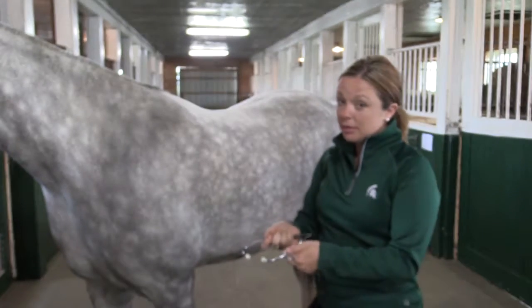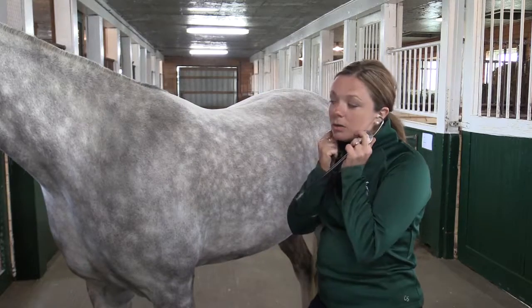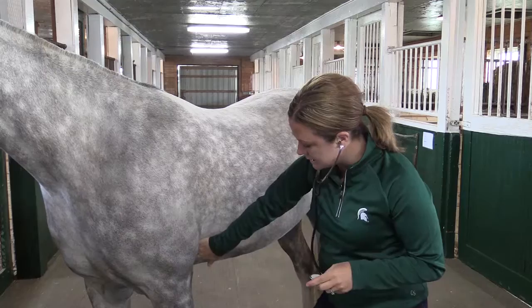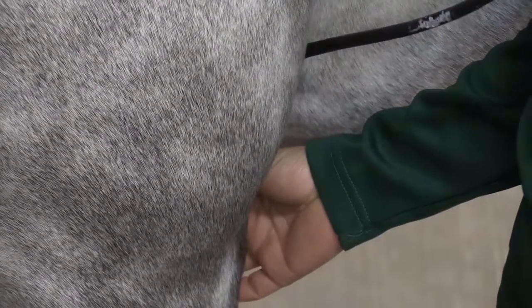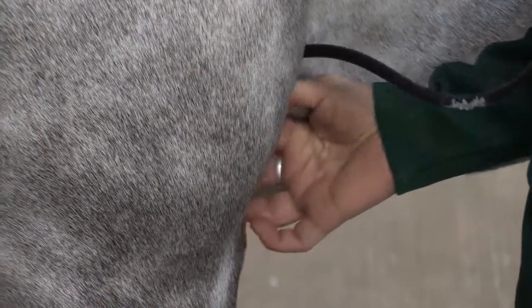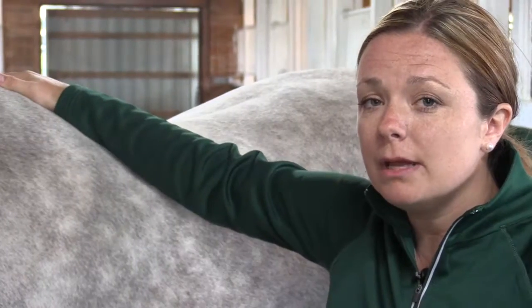I'm going to put it on with the ear portions pointed towards my nose when I put it on, and I'm going to want to put this right behind the horse's elbow against the rib cage. What may surprise you if you've never listened to a horse's heart rate is it's actually a pretty faint noise — I thought it would be much louder myself. We'll expect to hear that horse's heartbeat about 28 to 40 times within a minute span.